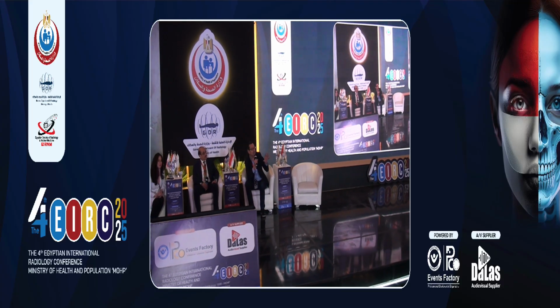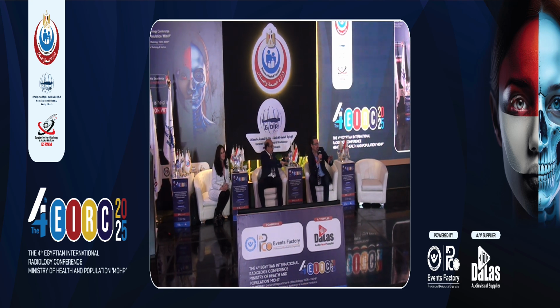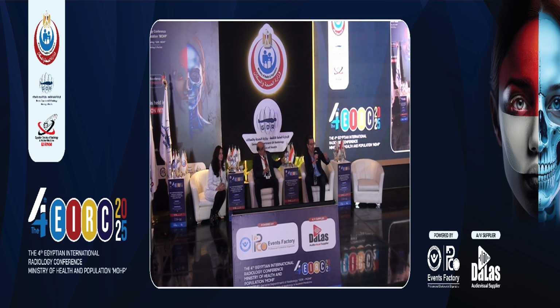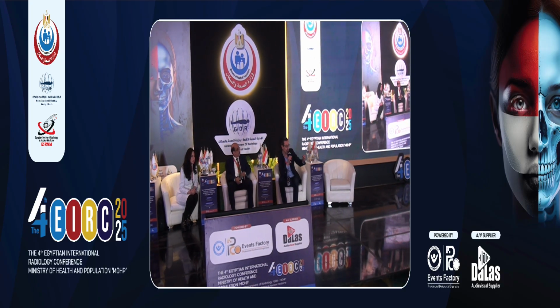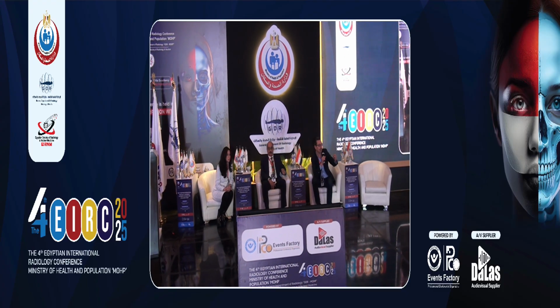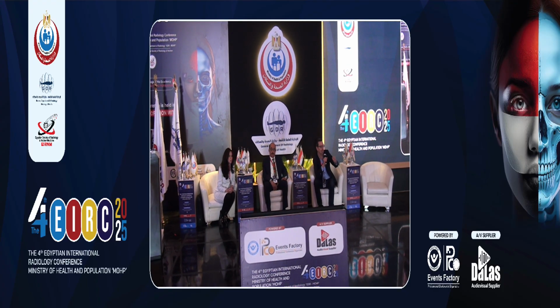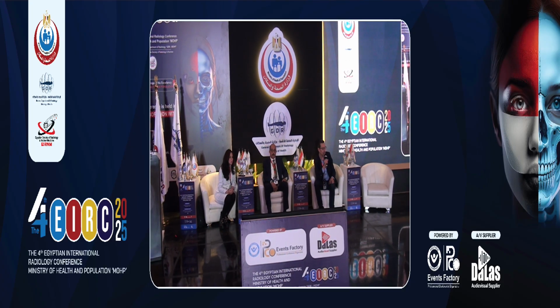Shady, so what's the advantage? In Europe, I don't know how it is in the US, but the majority of those stents are put under endoscopy. They almost don't choose fluoroscopy. So what is the difference for you, and why is it better to use fluoroscopy than do it under endoscopy only?